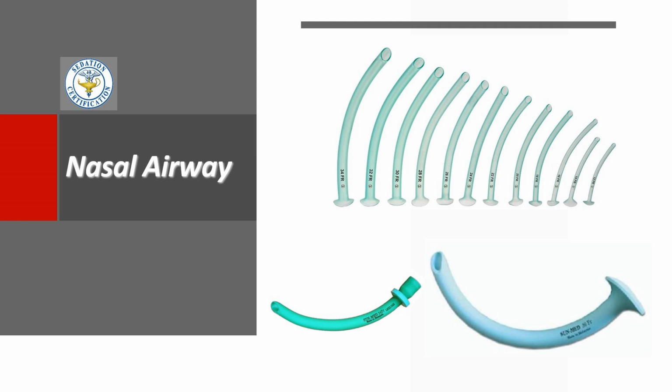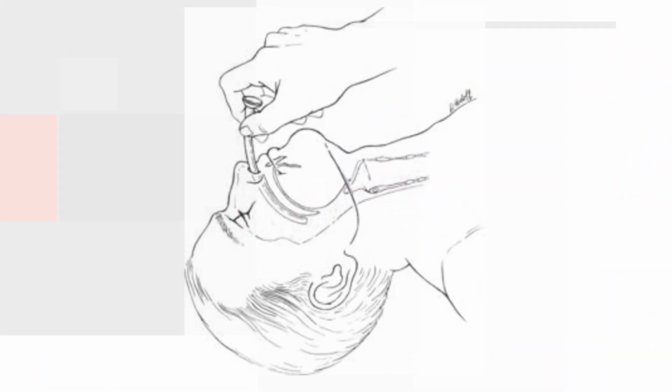Say, hey, let me see, blow through your nose. Now, if they've got a really bad cold, they shouldn't be there anyway, so there shouldn't be a lot of snot running around, so it should be okay. All right, so here's what it looks like. Now, this is the other thing.